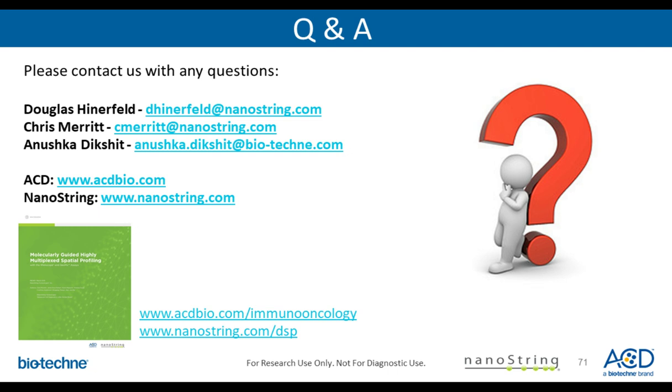Sure. What kind of method do you use to validate your RNAscope data? If you want to assess the specificity of the staining, you can use a positive and negative control, which are specific probes that we provide with the kits, and that way you can really discern between specific and non-specific staining.